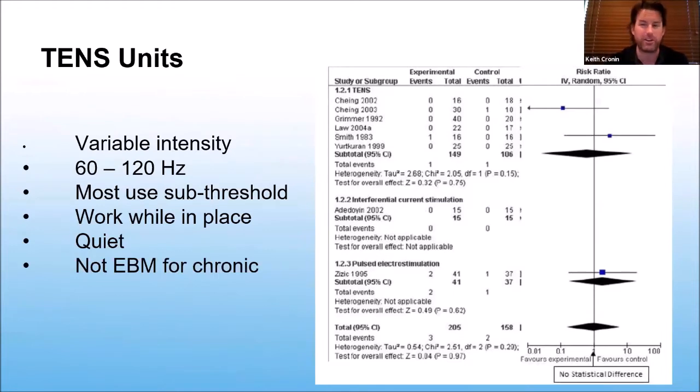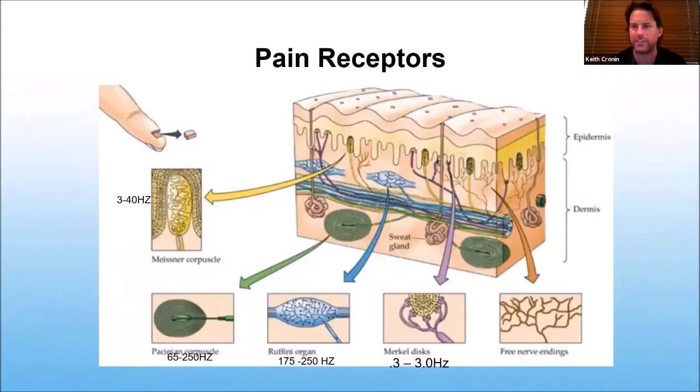Well, the trouble though is if you use tools and then you use tape, you can't even have your TENS unit attached to it because it can't go through the tape. And then your tape has trouble sticking on there. And so you're like, well, what do I do? Do you have to send someone home to do something to address all of this stuff? Try to go explain the frequency of hertz to a patient and saying, this is the particular hertz that's going to control this particular type of pain. Well, that's not fun. But what we know, though, is that if we work with the science of things, we can address all of these issues right here.